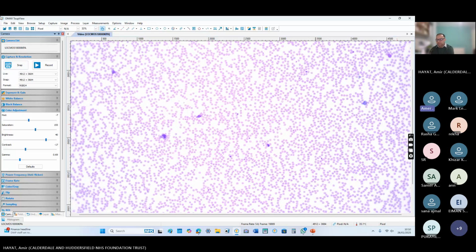So this is a 7-year-old boy who has been referred to hematologist because of recurrent, spontaneous epistaxis, and the blood film goes to the lab scientist. The lab scientist has noted thrombocytopenia in this patient.